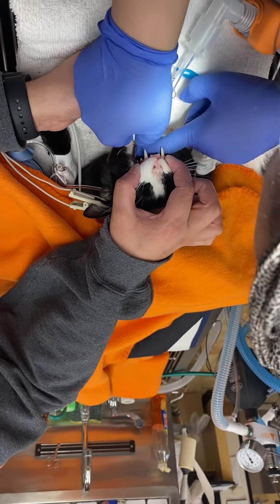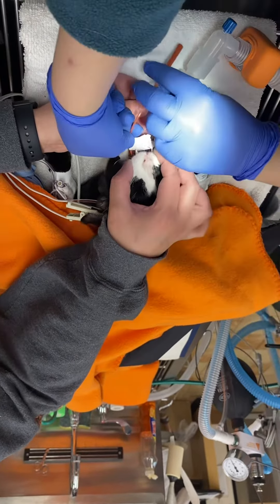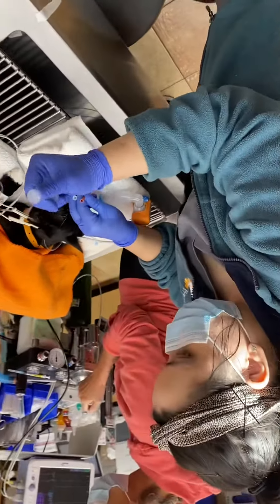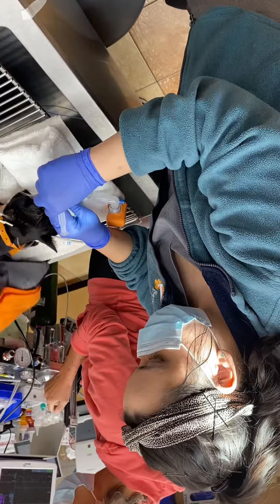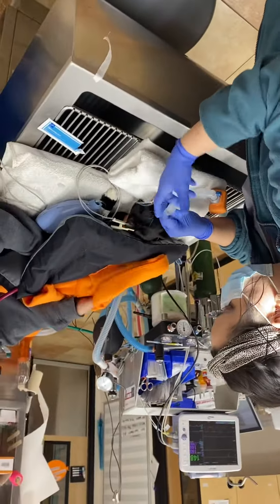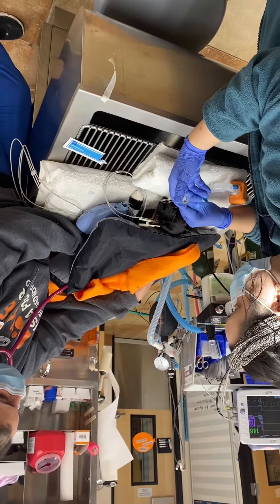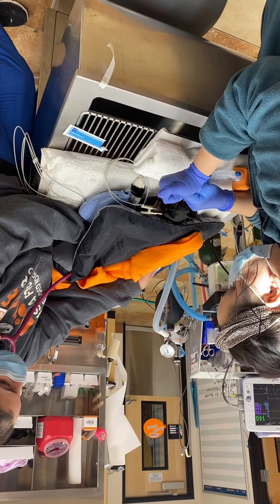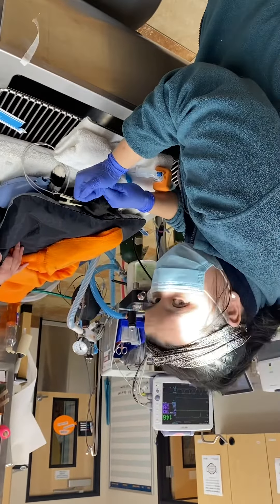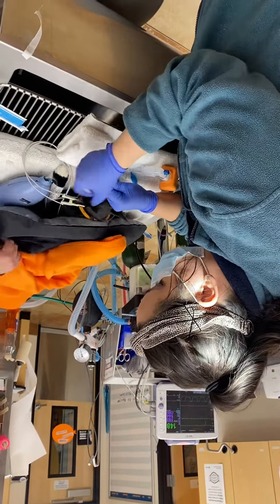Now it is in to the point I want it. I will be taking this syringe with air and blowing it in to make sure it is in. It is in, and I will be now removing it slowly.